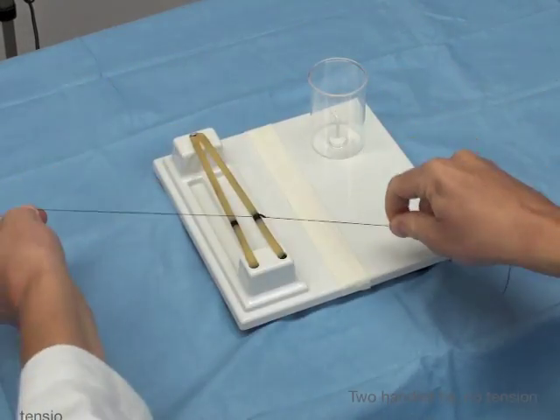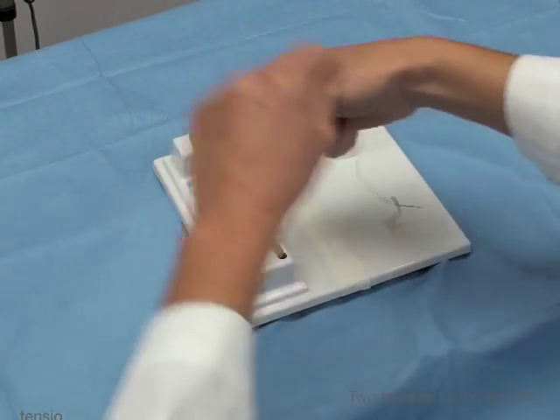And that's how you do a two-handed square knot.